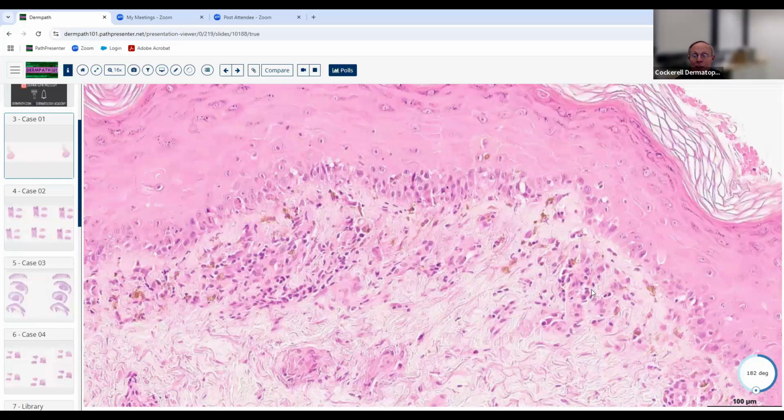You've got a T cell mediated response that's reacting to the skin. Basically, in a drug, you've got an antigen, a hapten, that comes up here, and it really does the same sort of thing. So it makes sense that they would look the same. So you're not going to be able to tell them apart histologically.